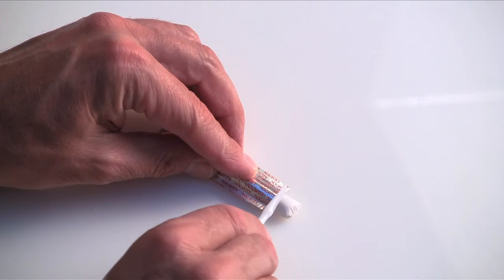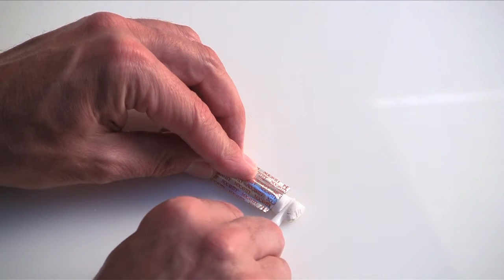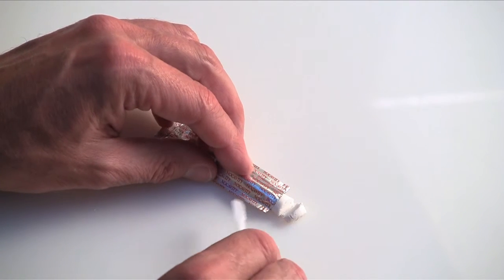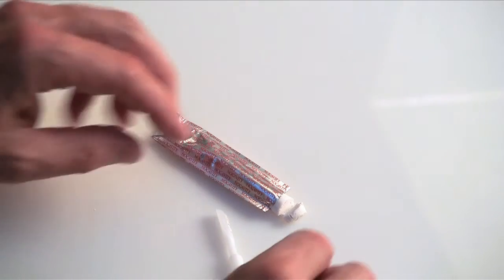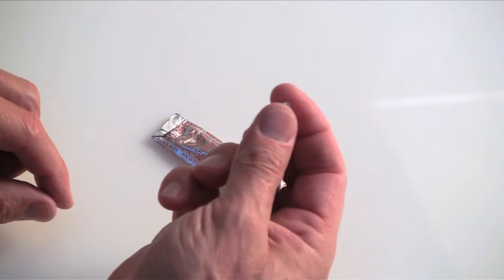Using the enclosed spatula, cut off a quantity of No Cavity sufficient to fill the cavity. Shape the material into a cone.